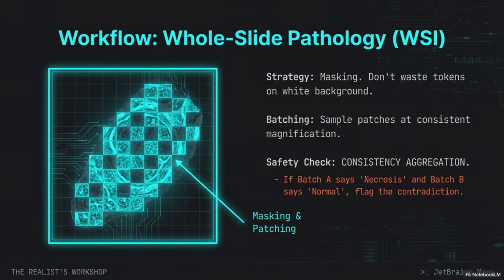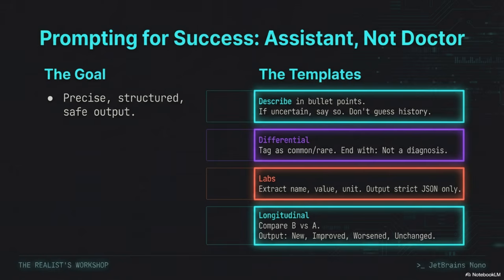Okay, finally, let's address laptop limits and the QA loop. Everyone asks if they can run the 4B model on their personal machine using something like llama or GGUF quantization. For purely text-only experimentation, sure, a laptop can be fine. But for the real CT and WSI workflows, you will hit a wall and you'll hit it quickly. A dedicated GPU is still necessary. Why is that? Because the vision pathway and just the sheer memory bandwidth required for those intense pre-processing steps demand it.